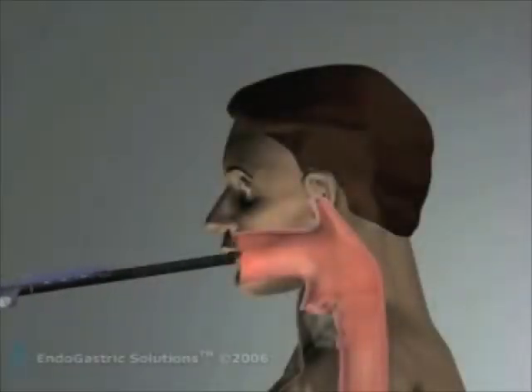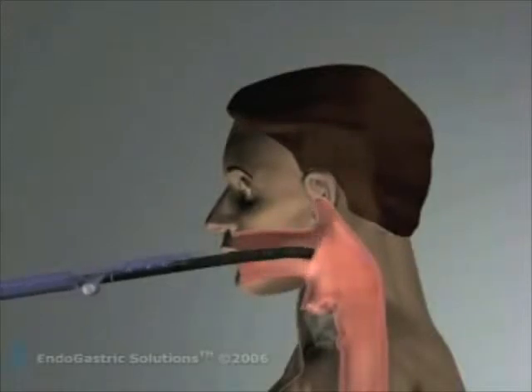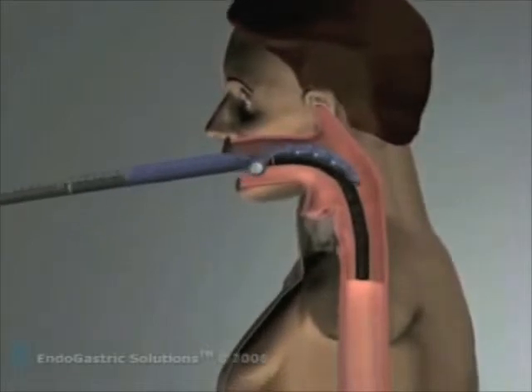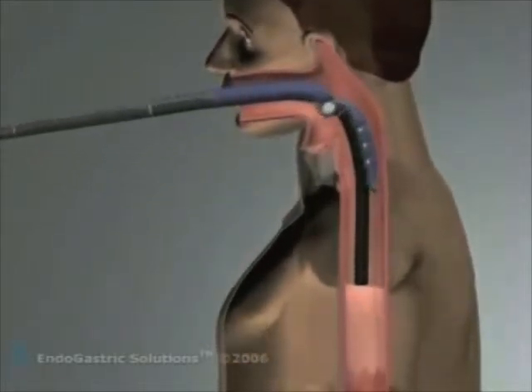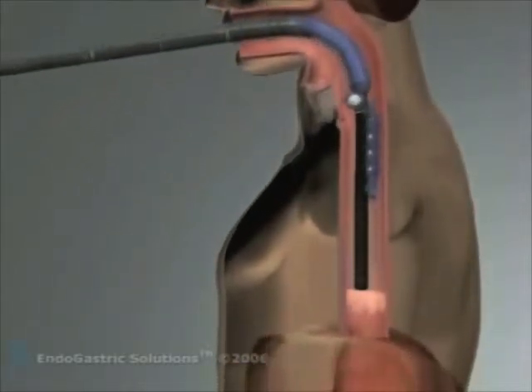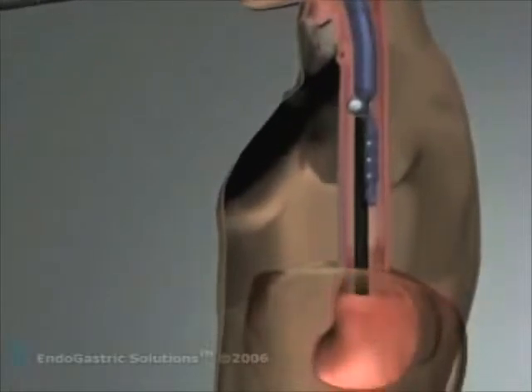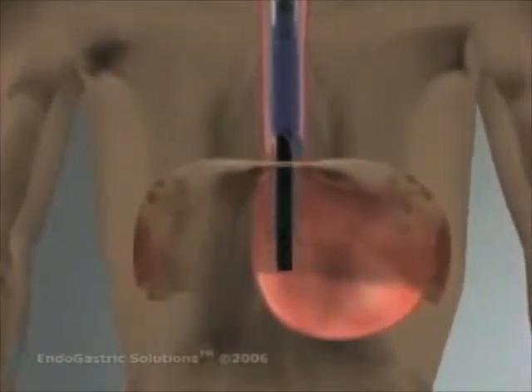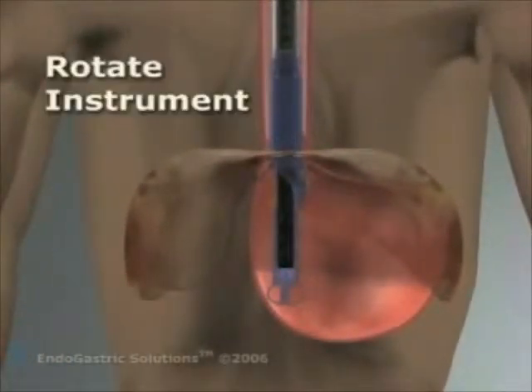The working end of the esophagus device is a complex 7-lumen instrument that enters the mouth of a patient riding over a standard endoscope. Under general anesthesia, a team composed of a surgeon and interventional gastroenterologist position the device for surgery. The stomach is inflated and the endoscope is advanced and turned into a retroflex view so that it is looking up at the gastroesophageal junction.